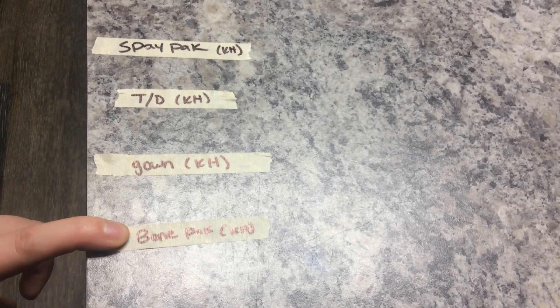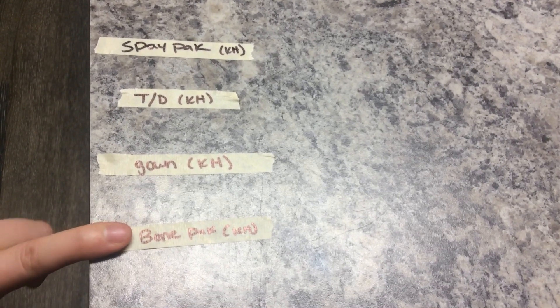This is for ACLs or other major surgeries besides spays and neuters — this is that pack. And that's how we label them with initials too.